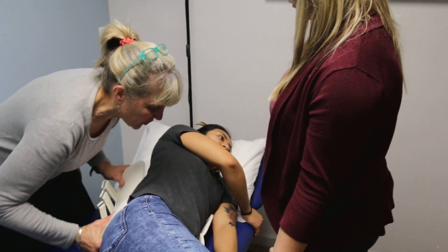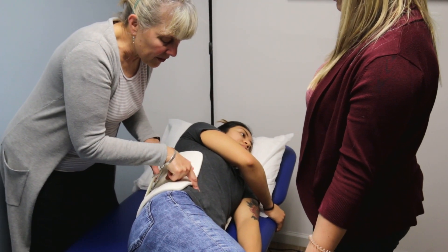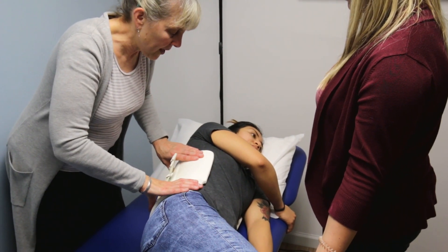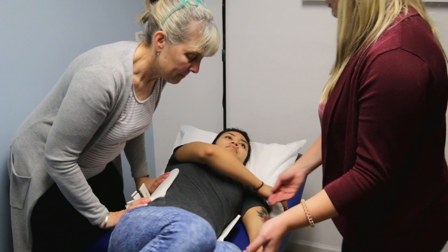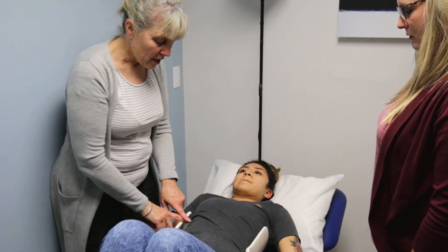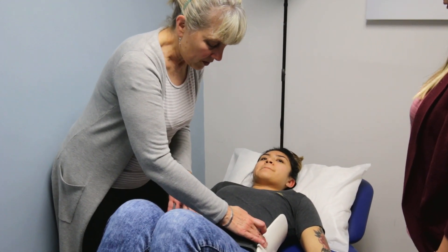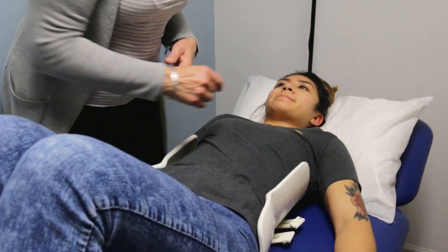This is all part of your spinal precautions. Getting the brace halfway under, making sure we're at that waist divot, and rolling flat back. Once you have it centrally located, you want it midline, making sure that we're at the waist creases, and then we can start to put the front on.